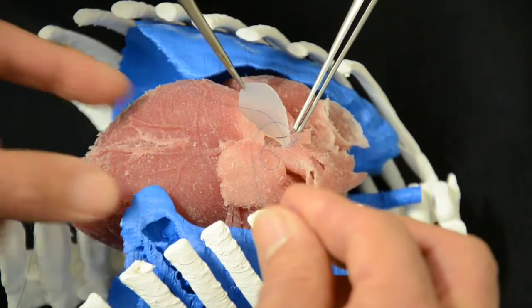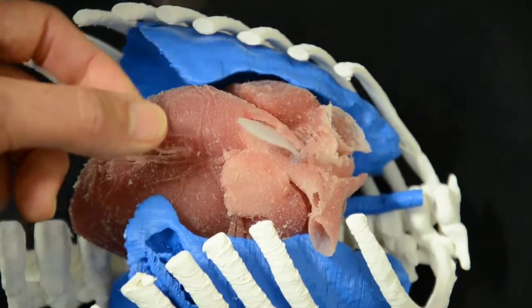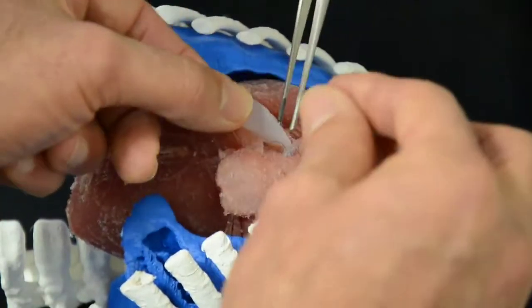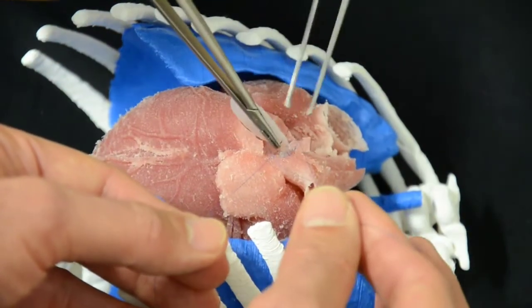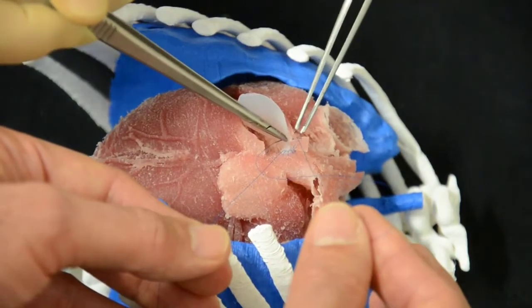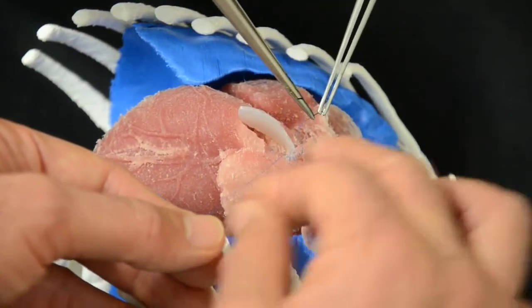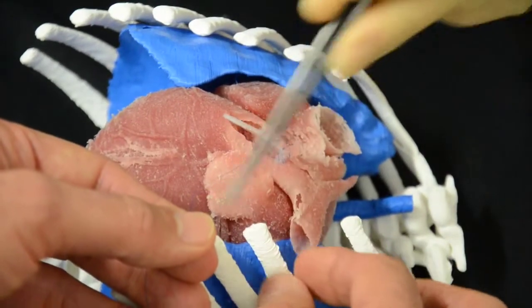As Giuseppe clearly says, one of the keys of working with small babies is that the tissues and arteries are very, very fragile. This material gives us the sensation that you cannot be too rough — you have to be very delicate, which is an excellent way to train, otherwise this can tear very easily.